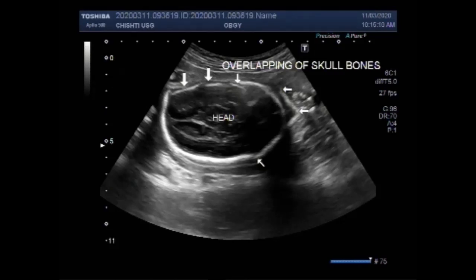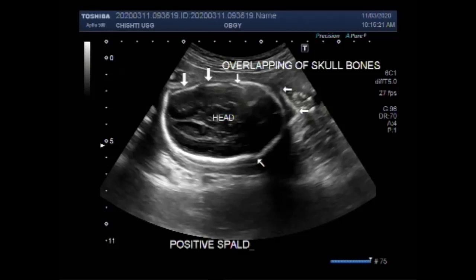This Spalding sign is a sign used in obstetrics and is an indicator of fetal death. Most estimates place the precise time of fetal death at about seven days or more before overlapping and separation of fetal skull bones appear.